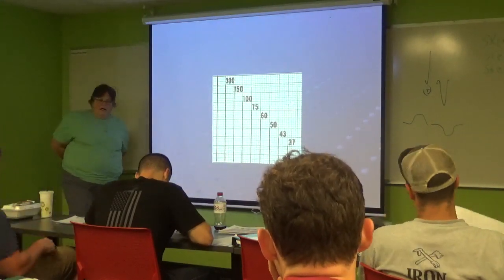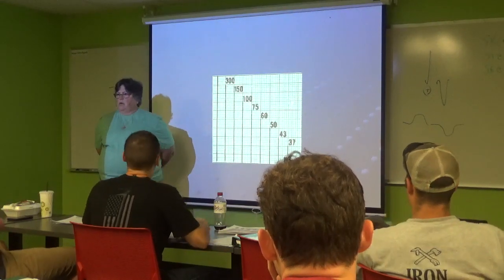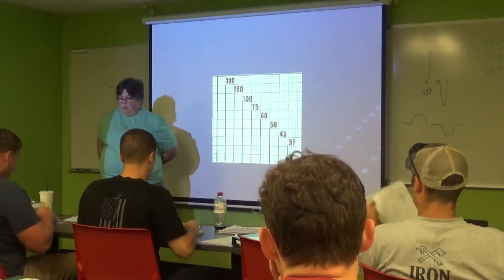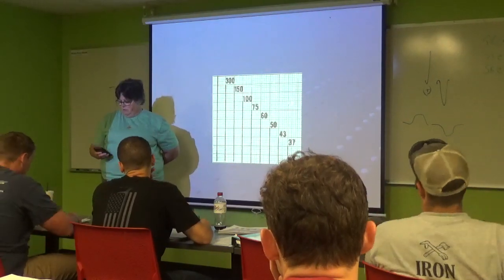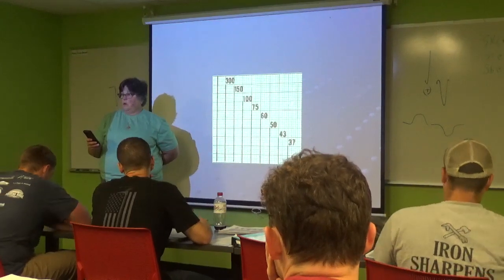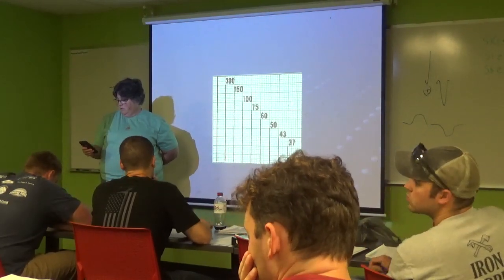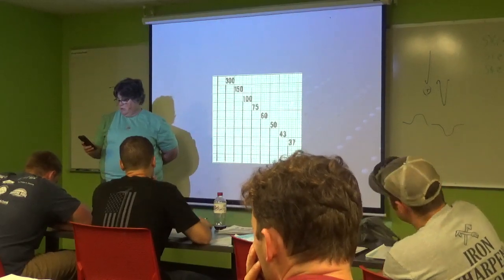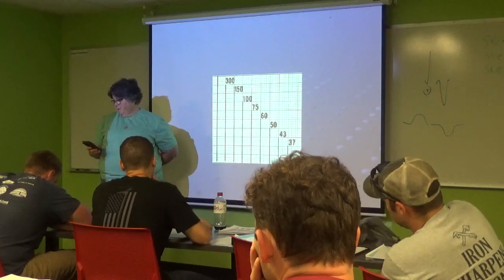Now, why do I have you do your intervals next? Why do I care? I haven't told you. Identifying your rhythm, what's wrong, and to be in control. Could they want drugs you can't give? So that's one thing, that's correct. What's the big thing? What does your sheet say?